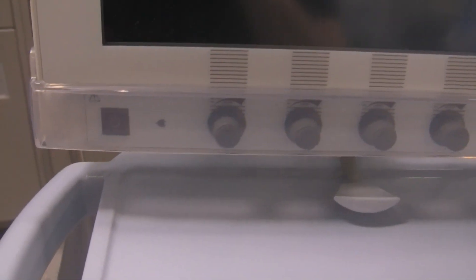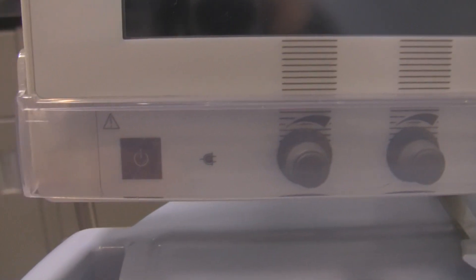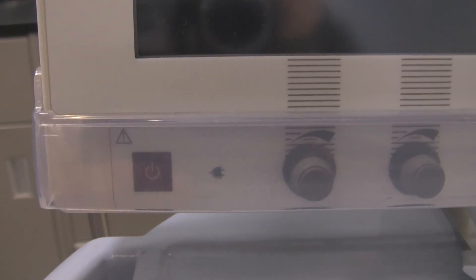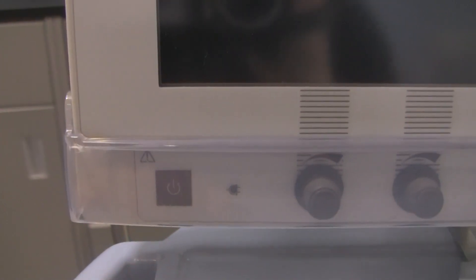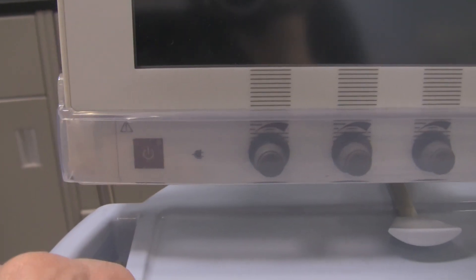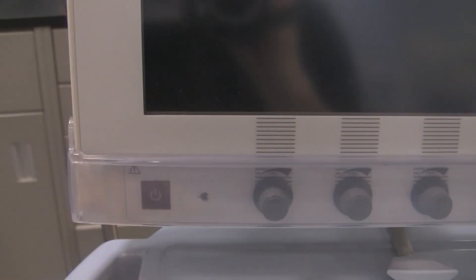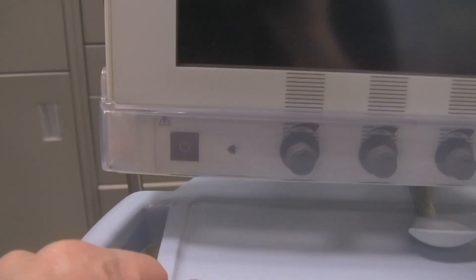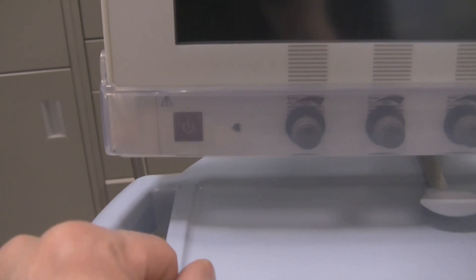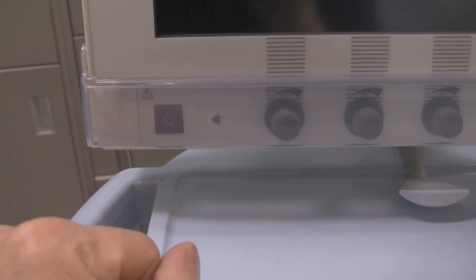There's another little tab underneath this plastic case. Now if you look closely, it kind of looks like an on-off switch like you see on a lot of different appliances. This is actually a button you push to take the ventilator out of standby when you want to start ventilation. You can also use it to put the ventilator into standby if you need to disconnect your patient for transport or something like that. So it initiates ventilation and puts the ventilator into standby depending on when you push it.